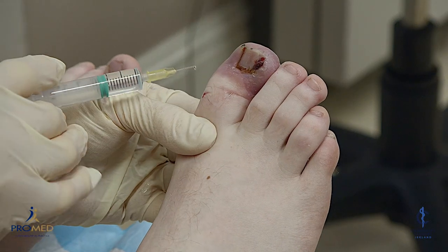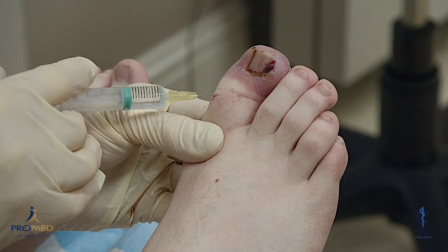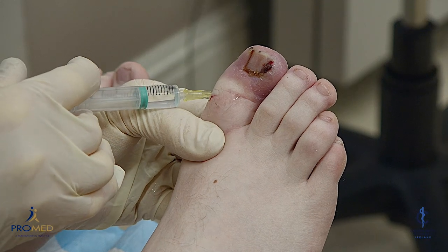Now I'm going to put a bit down the side here, just at the back of the nail. Pinch here — a small bit down at the back.